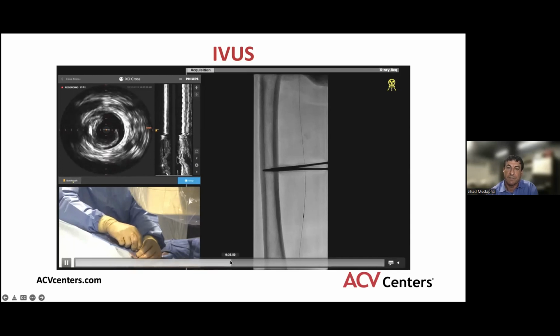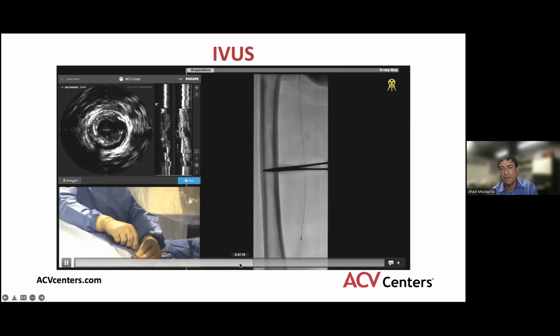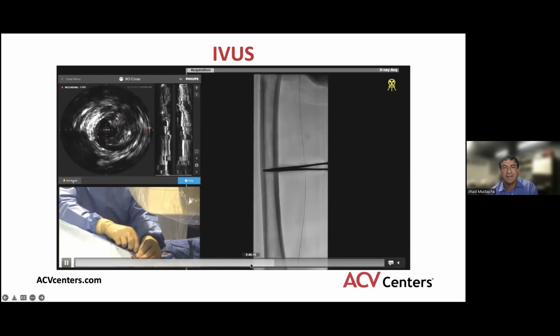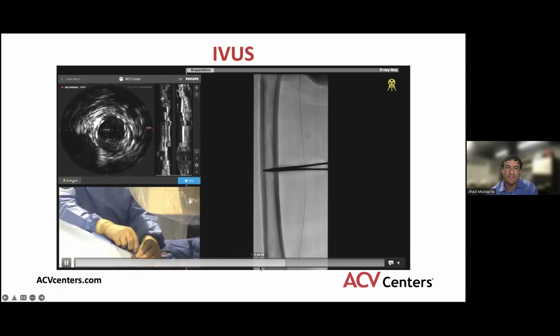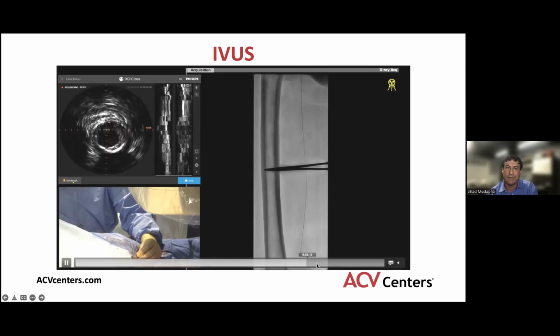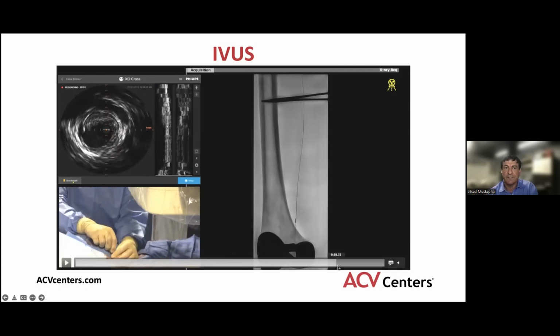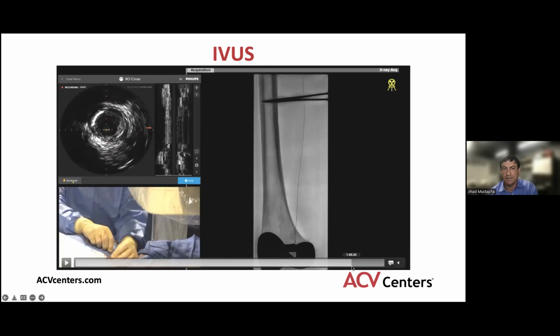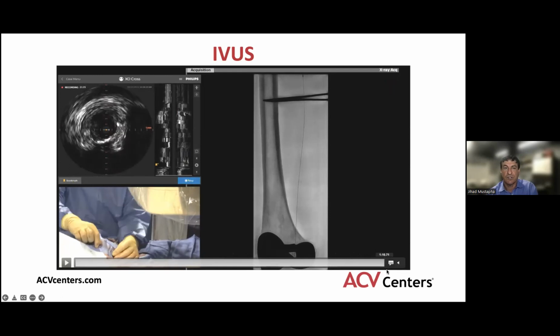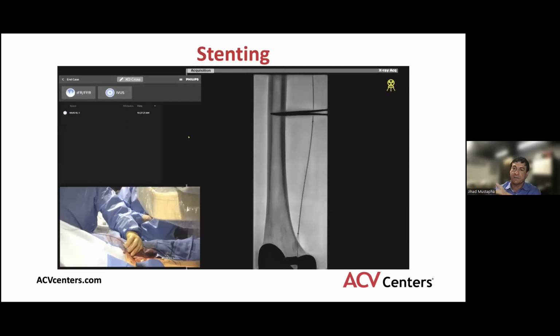There are a lot of different things that can be done, so we can think about that as we go. The vessel is very well prepped, but not so prepped that you can just walk away from it, and you can still see high plaque and organized thrombus present. So how do we control this? What would we do now to ensure that none of this will embolize distally? Let's go back and check the P3 segment, making sure that nothing's changed in it before we do anything else. Nothing has changed except the size of it got bigger.